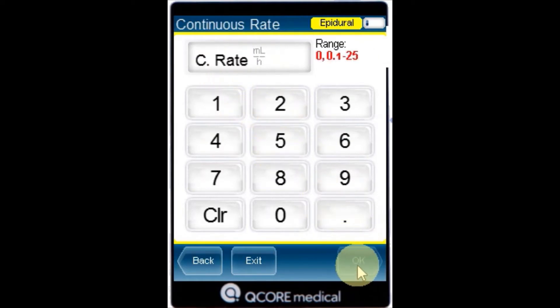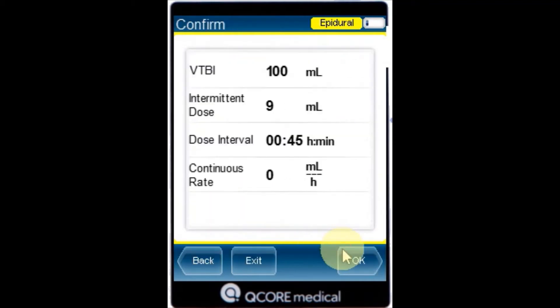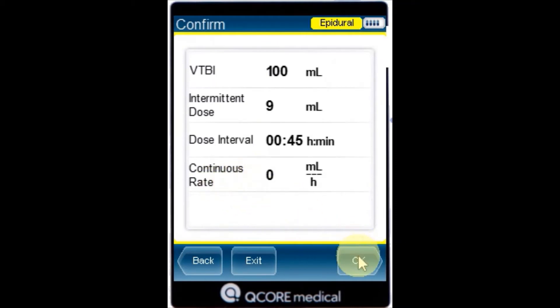Using the keypad, enter the continuous rate and then press OK. Note, the continuous rate may be set to zero. Review the parameters displayed on the confirmation screen.